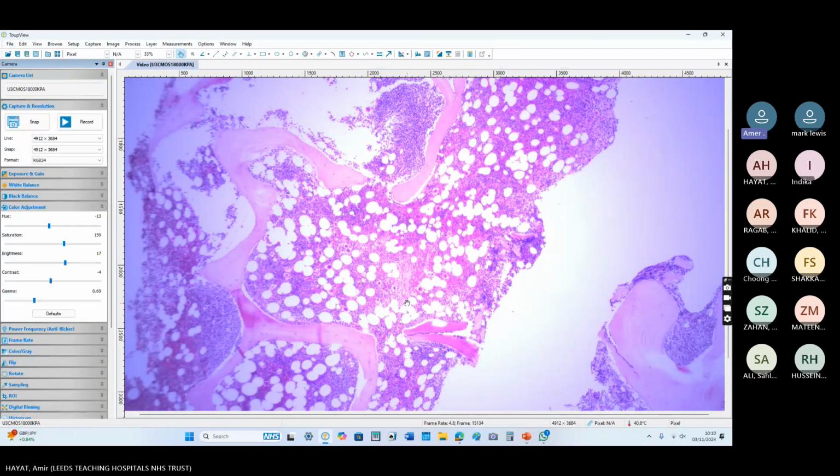We had seen previously anaplastic large cell lymphoma trephine, which contains horseshoe-shaped cells, the specific cells for anaplastic large cell lymphoma. We had seen previously Waldenstrom trephine, which shows nodular infiltration. So there are certain features of diseases in the trephine which, if you remember, you will pick up in the exam easily.